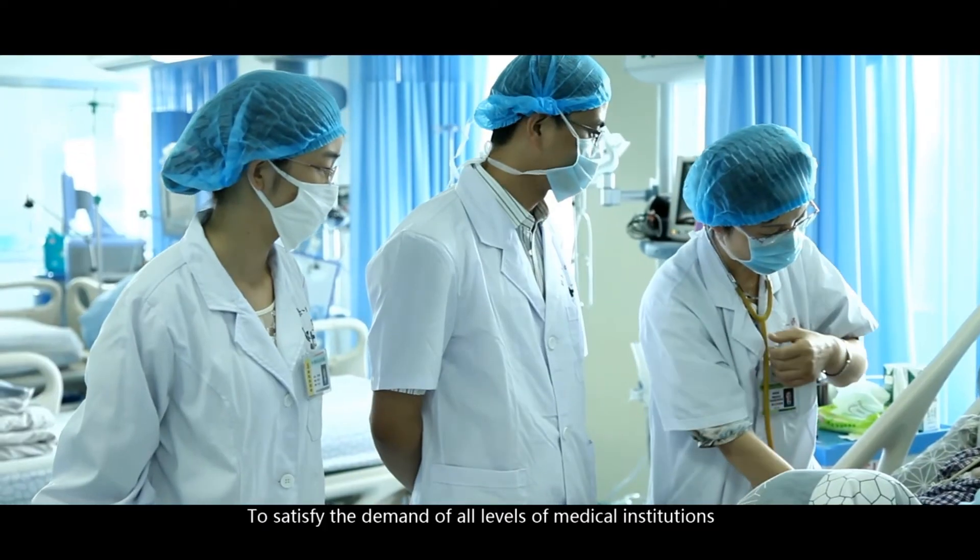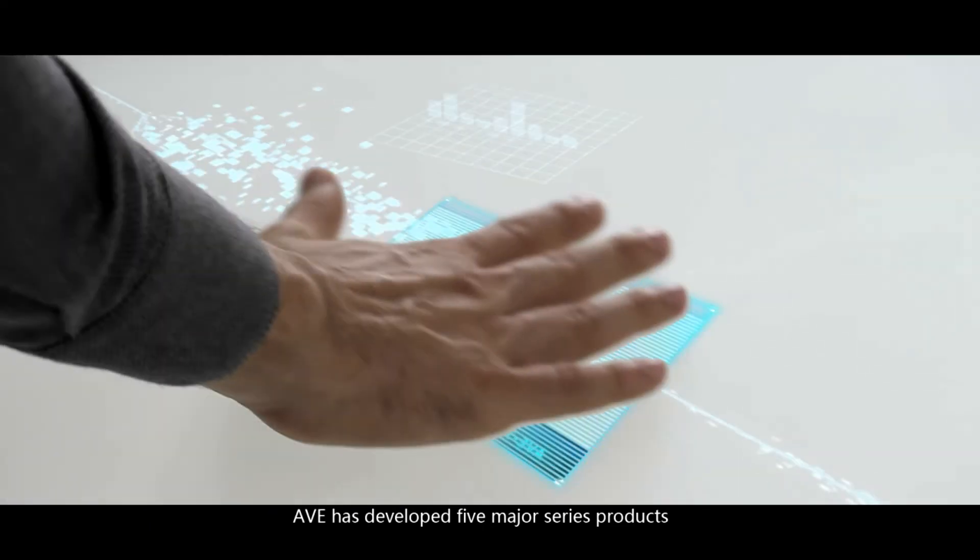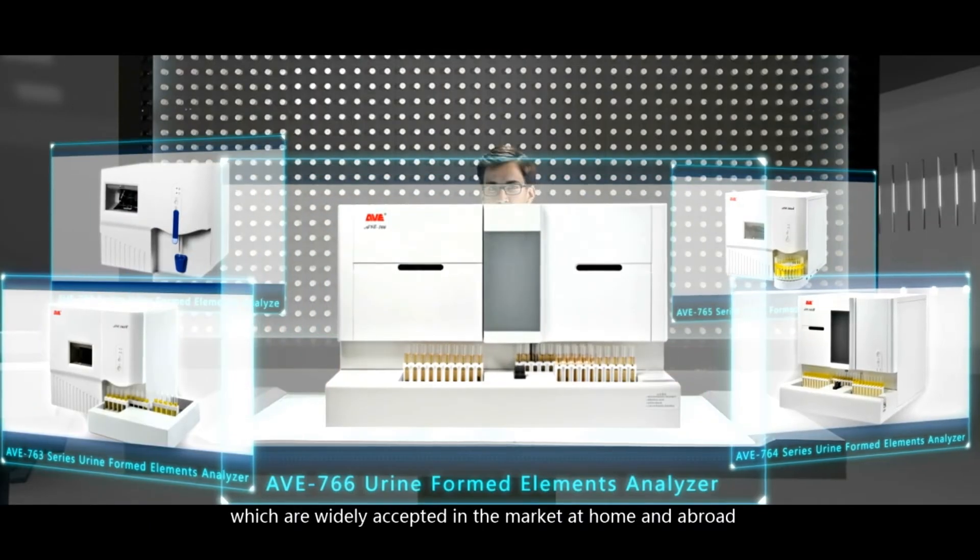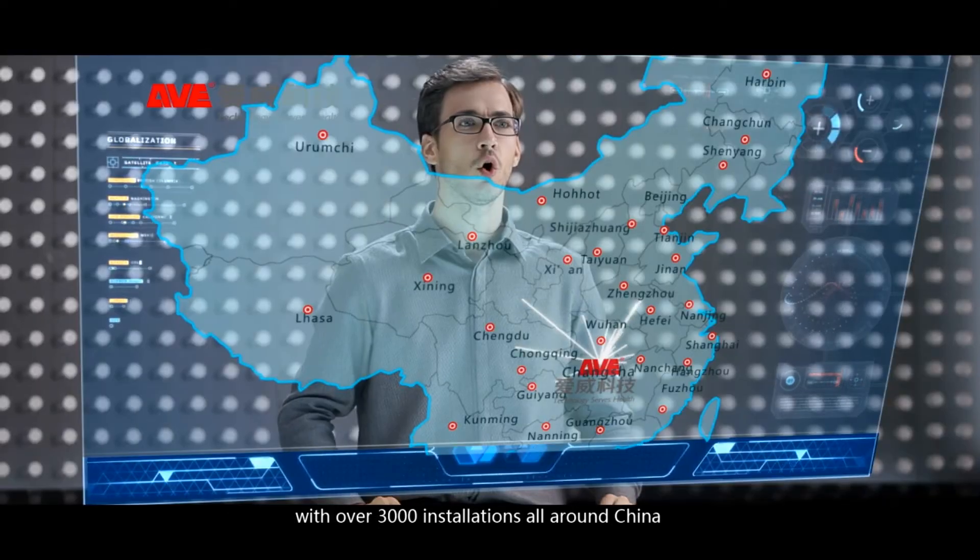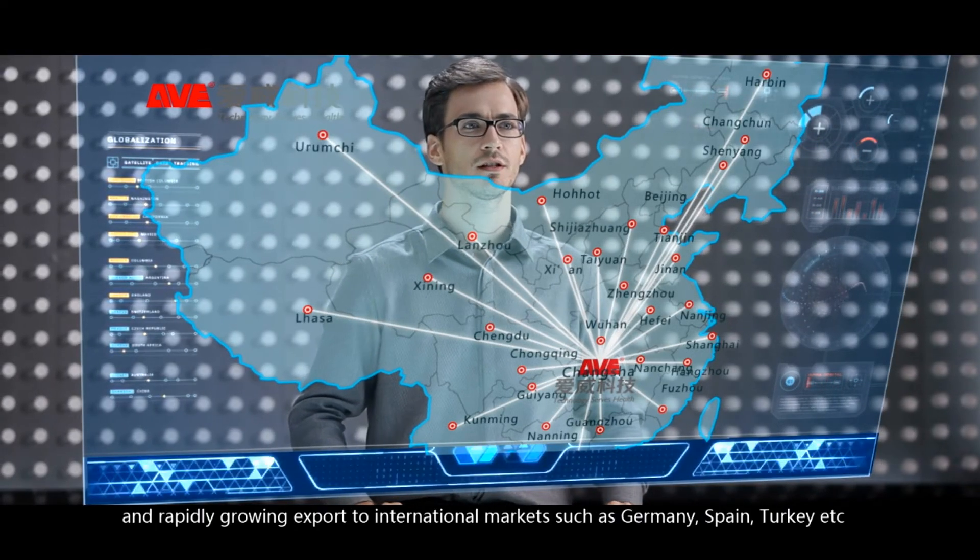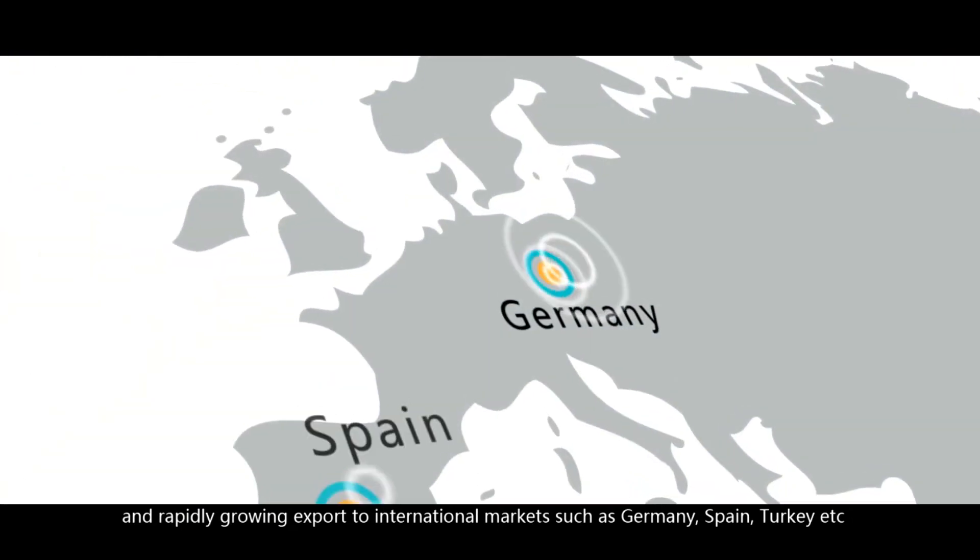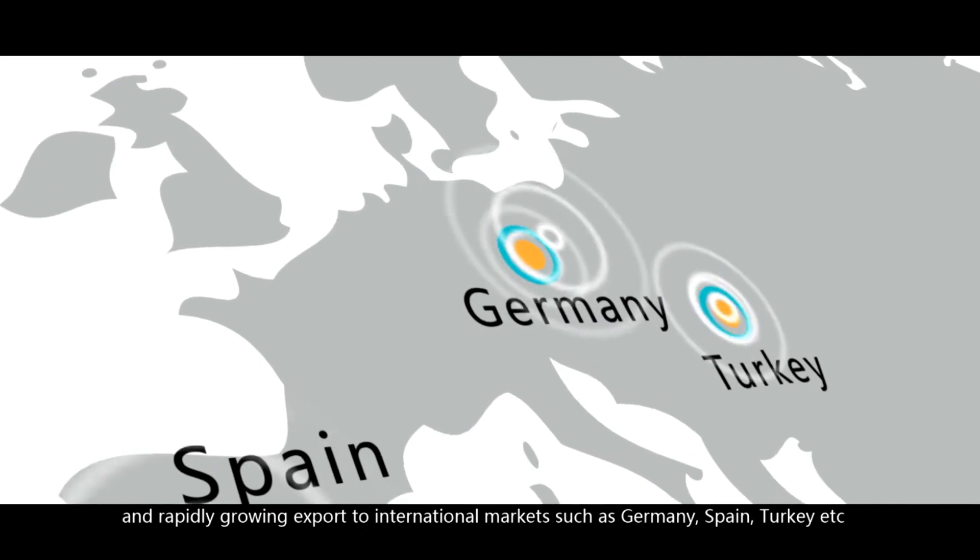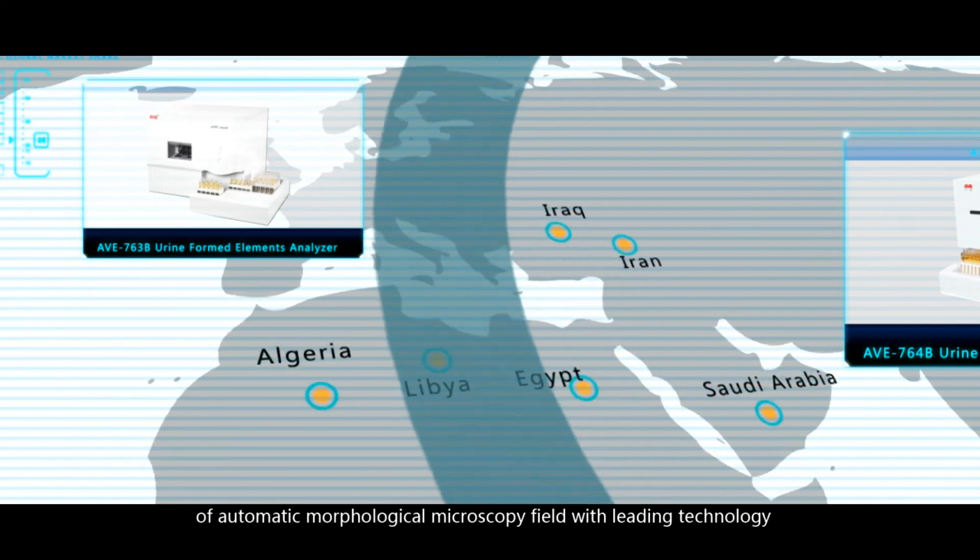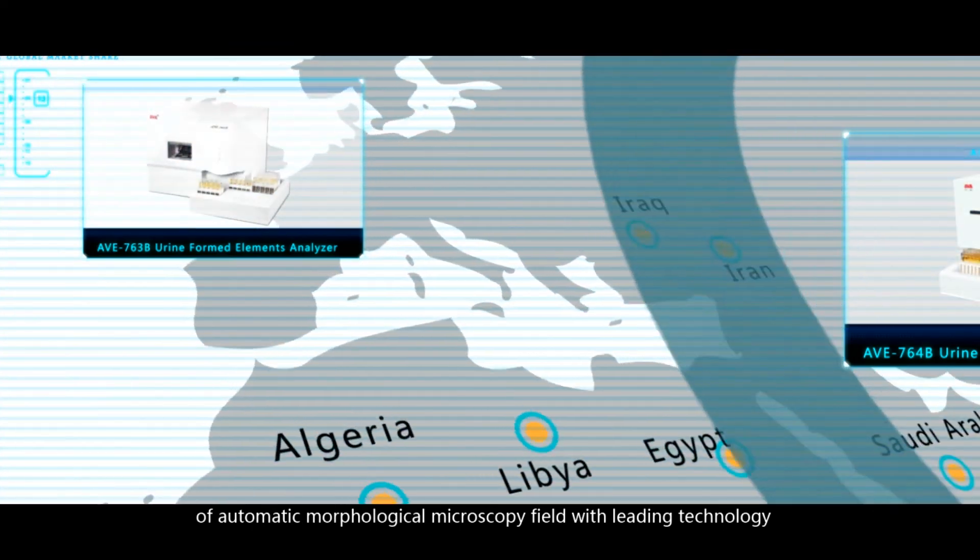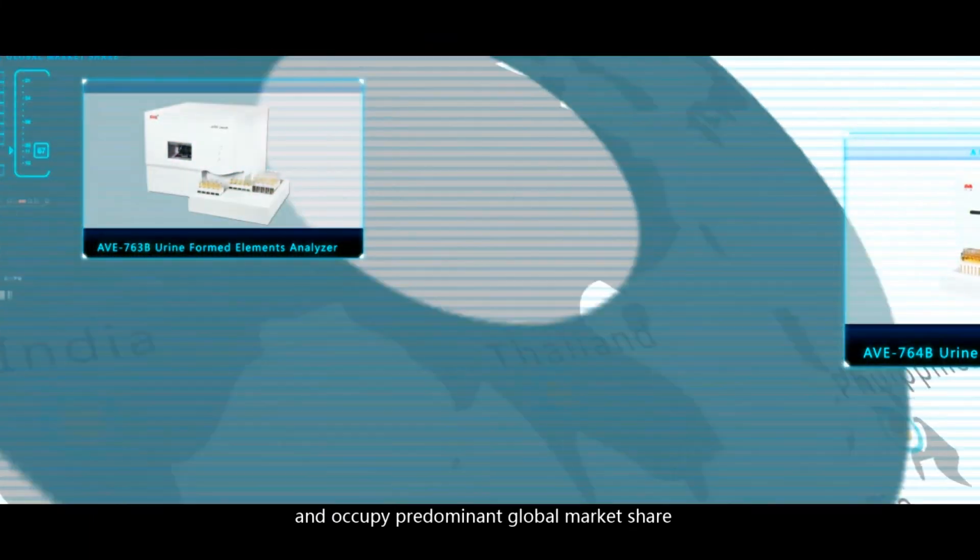To satisfy the demands of all levels of medical institutions, AVE has developed five major series products which are widely accepted in the market at home and abroad with over 3,000 installations all around China and rapidly growing export to international markets such as Germany, Spain, Turkey, etc. AVE-76 series analyzers fill in the technical blank of automatic morphological microscopy field with leading technology and occupy predominant global market share.